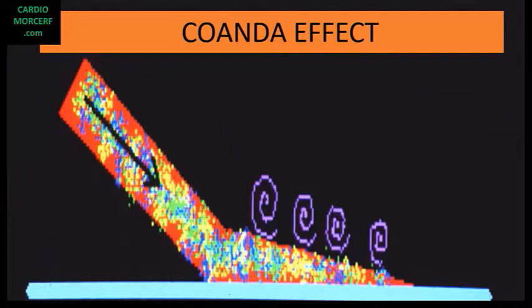However, this increase in mass only happens on the free surface of the jet. The other surface is trapped on the wall and there is no blood to join the jet, and then there is no increase in mass at this side. So the jet now consists of two layers, one at the free surface having more mass than the other at the wall.